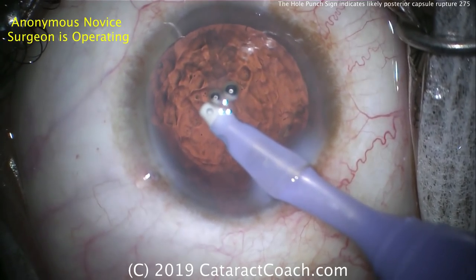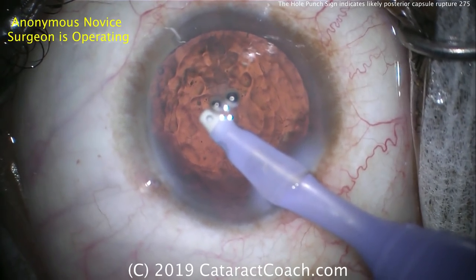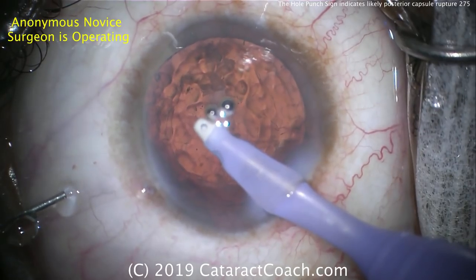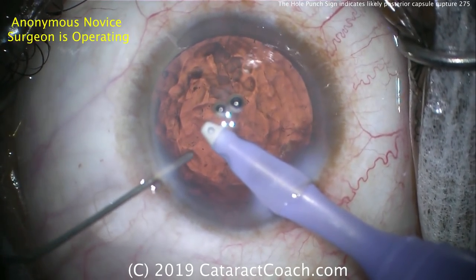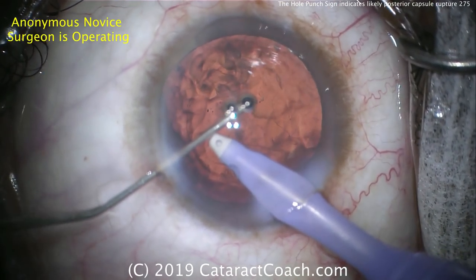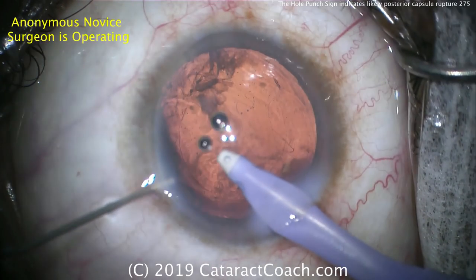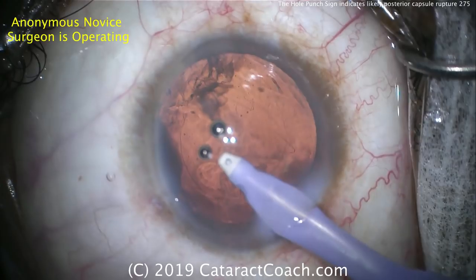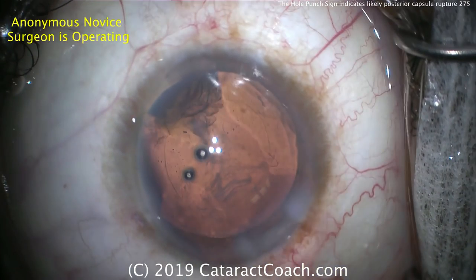More viscoelastics are going into the eye prior to removing the IA probe — that looks really good. It looks like most of the lens cortex is out; this looks pretty clean. A little bit of extra viscoelastic — I like that idea. I always put in more viscoelastic. As I say: viscoelastic is cheaper than vitreous, so use as much as you want.